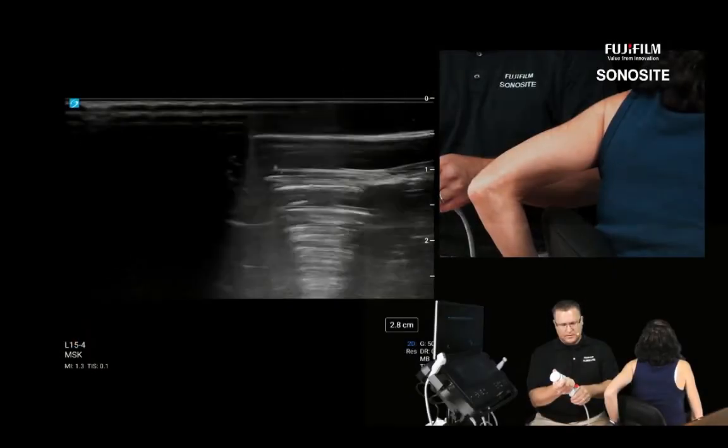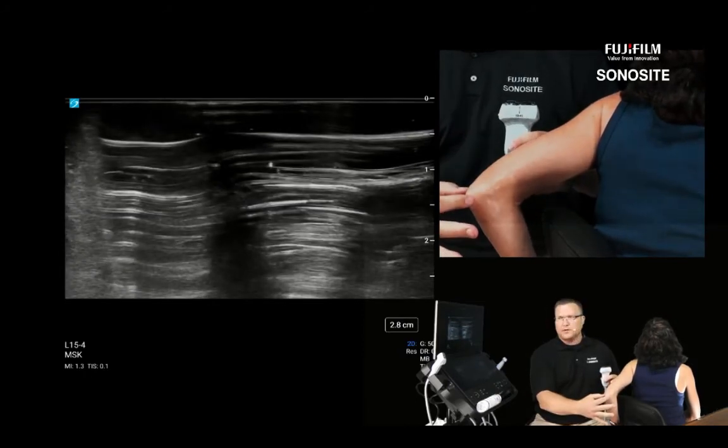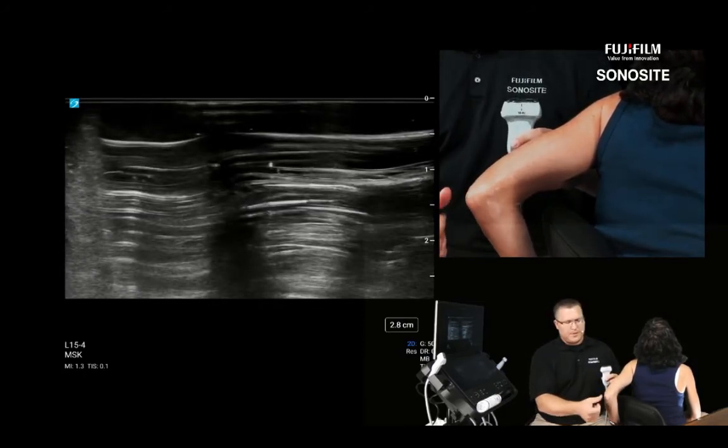I'm going to kick it off with the L15 right across the posterior olecranon surface again, palpating again depending on your position.